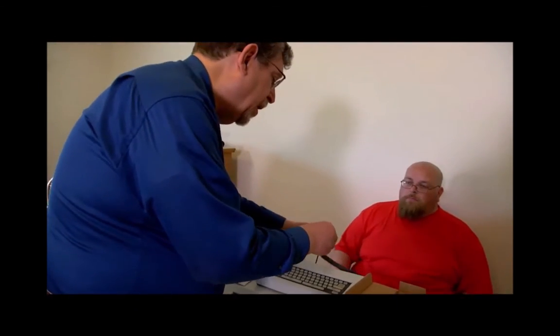I think our first one here. Alright, no alcohol, so we've got a control. Okay. This time, David, if you could stop and start. First off, try blowing for a short time and then try sucking back. What happens? And you suck back on the mouthpiece. Are you able to suck back on the mouthpiece? The reason why he's not able to suck back on the mouthpiece is that there's a one-way valve that prevents a person from sucking back.